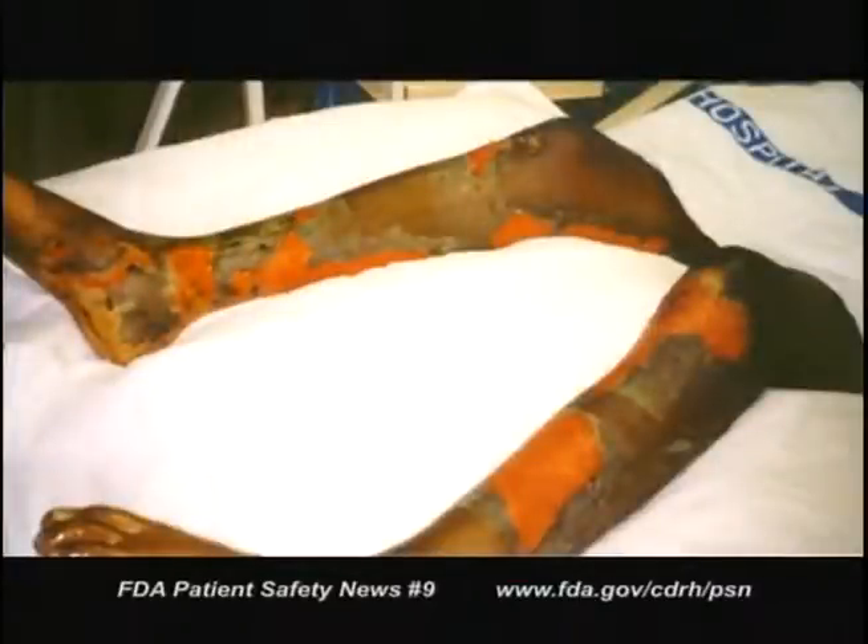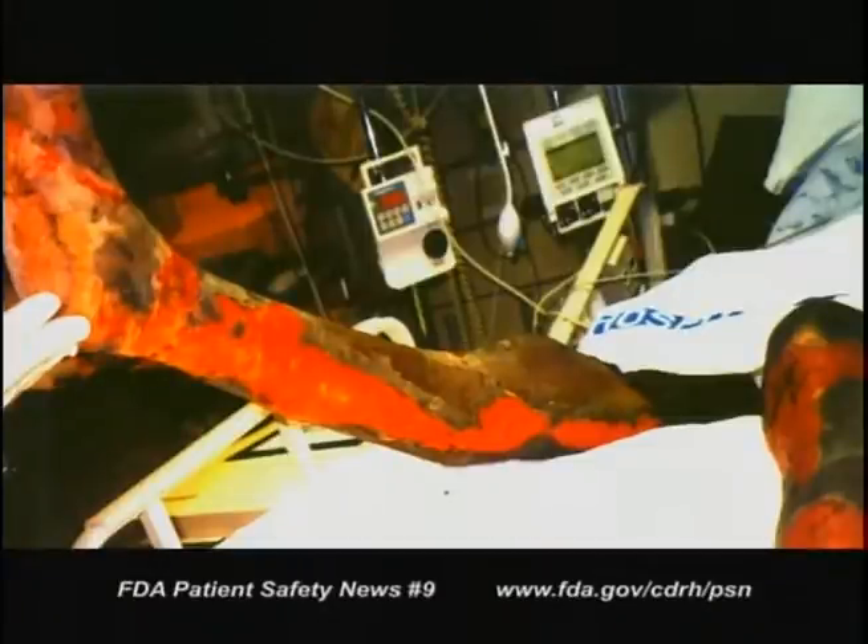Burns can also occur if the patient's skin comes in direct contact with the hose surface. This practice, where forced air warming is applied without a blanket, is called hosing or free hosing. Hosing has caused first, second, and even third degree burns. The most serious report we've received to date describes a burn that resulted in muscle necrosis so severe that the patient's leg had to be amputated above the knee. This kind of injury can occur with any forced air warming system that's supposed to be used with a blanket but isn't.